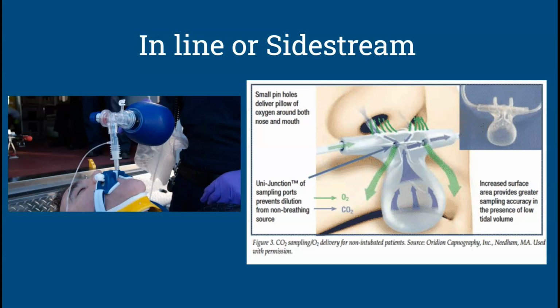So if you have a patient who's on a nebulizer, and they're inhaling and exhaling through a small mouthpiece, you can get a little creative to get a good idea of what their capnography is, even if you don't have this available. The side stream, not everyone carries it because they're super expensive. They're like $34 per cannula. So you don't see it in a lot of places.